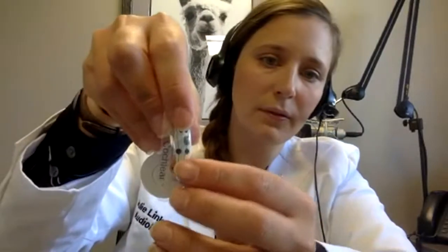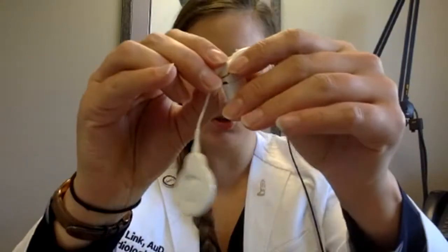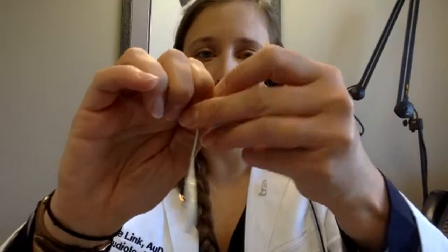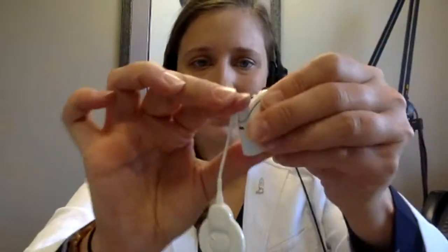Arrow towards front. Right like that to get them switched out. Peel that out, and that'll be a new one. All right, perfect. If your implant is still not working after you change your battery and change your mic covers, make sure that your coil is on nice and tight. If this is on loose, you might be able to hear, but it might be weak, or it might be distorted. So just make sure that's in there nice and tight.